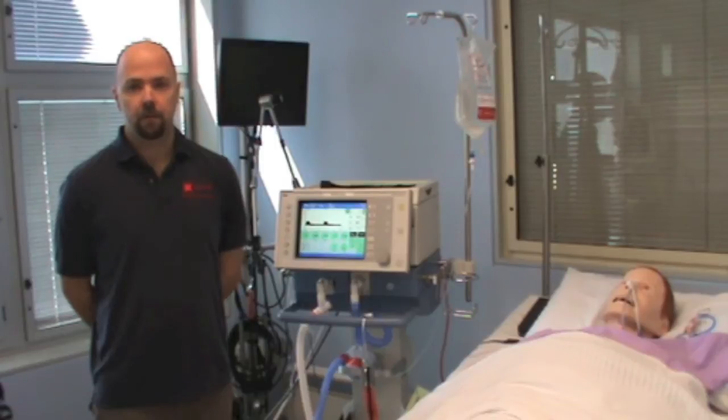In a previous video, we reviewed the most basic forms of mechanical ventilation, pressure control ventilation and controlled mandatory ventilation. We also looked at the basic settings, including fraction of inspired oxygen, respiratory rate, IE ratios, and either tidal volume or inspiratory pressure. Control modes of ventilation are easy to understand and are very reliable.